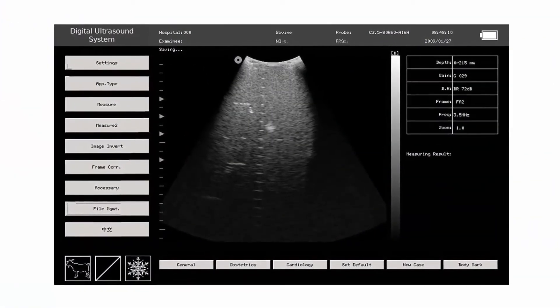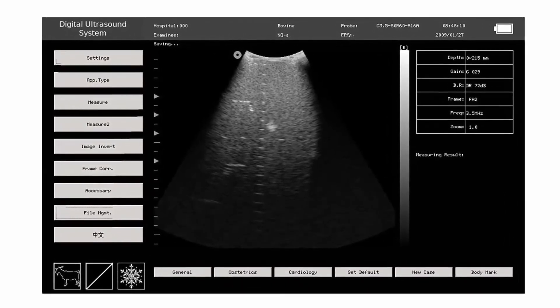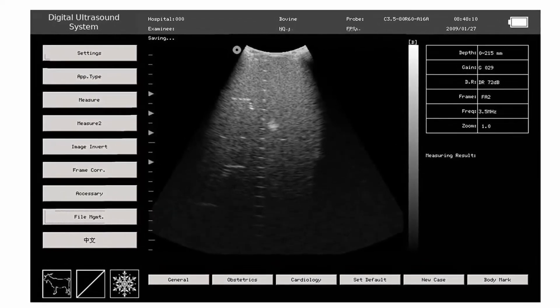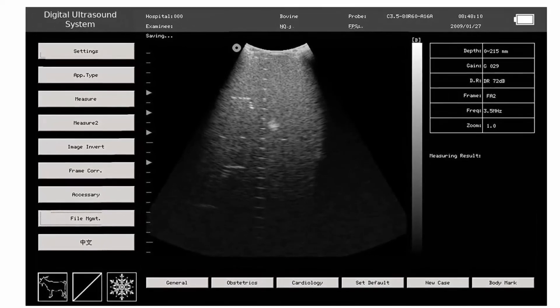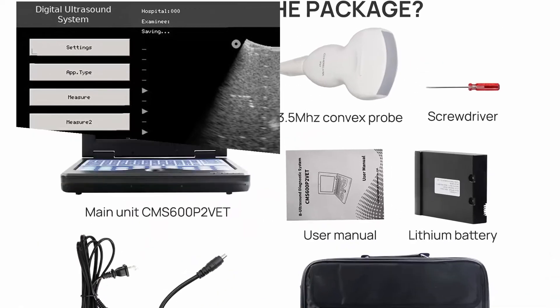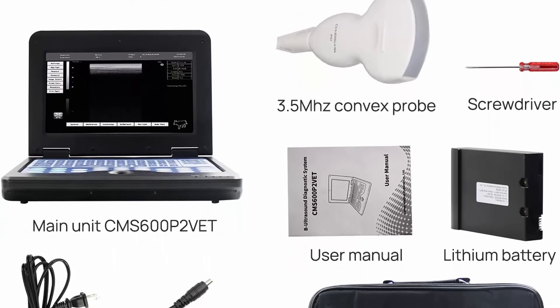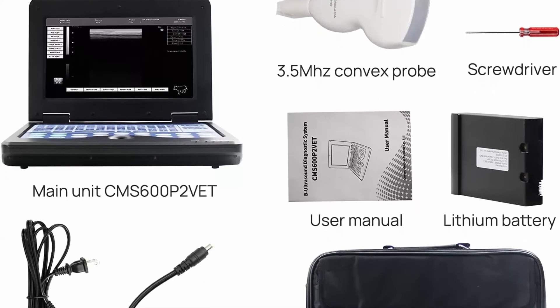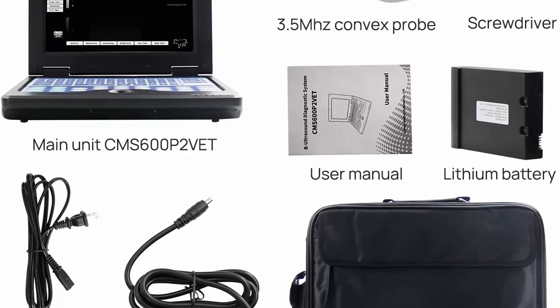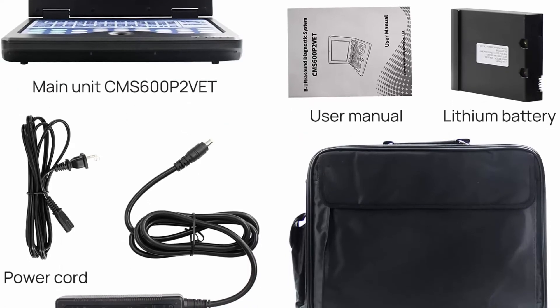The Contec CMS 600 P2 Vet is a veterinary ultrasound scanner for animal use with simple and easy image management. It features a 10.1-inch TFT LCD screen with display modes B, 2B, 4B, BM, and M. Its portable design is small and lightweight. The lithium battery can work continuously for up to 2 hours after fully charged. You can use it on a farm or at home.